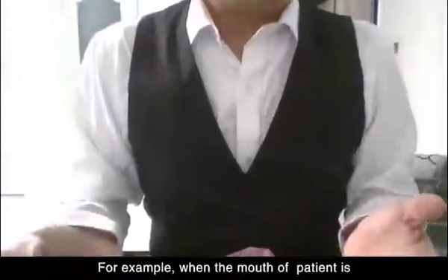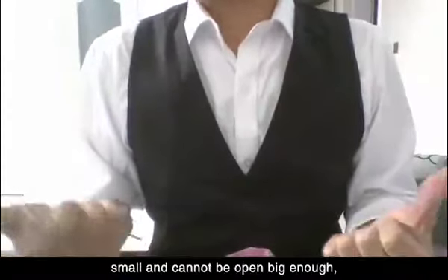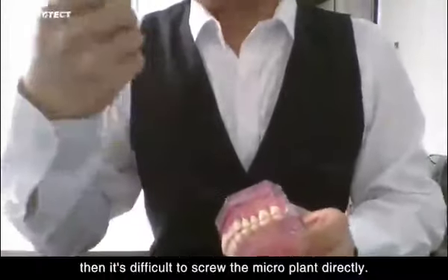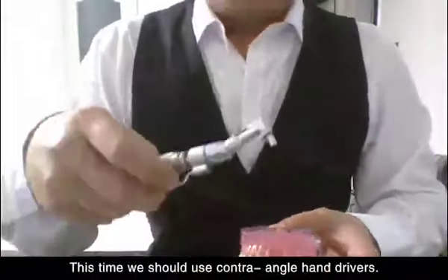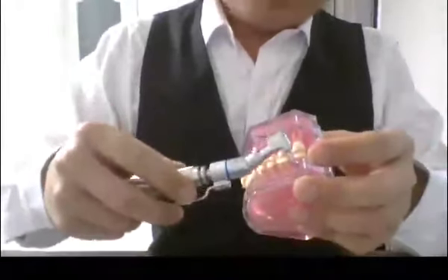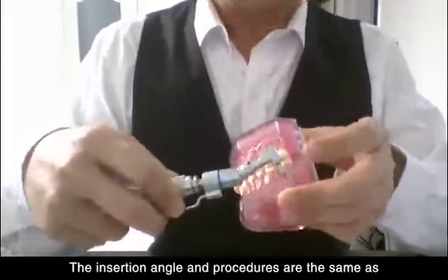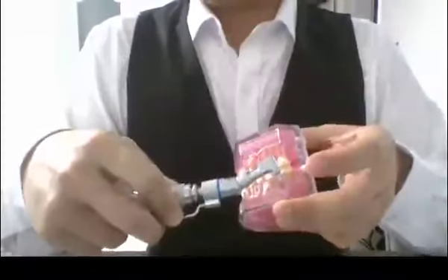For example, when the mouth of the patient is small and cannot be opened wide enough, then it's difficult to screw the micro-implant directly. And this time we should use the contra-angle hand driver. The insertion angle and the procedures are the same as the straight hand driver.